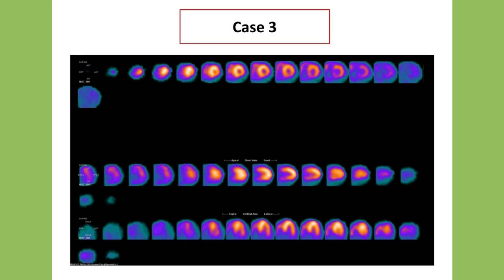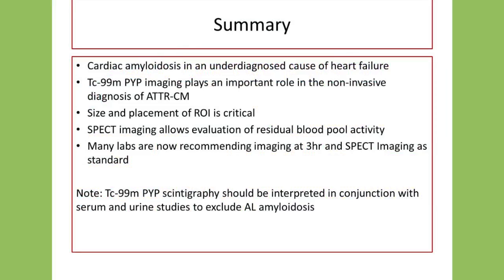So again, looking at the difference between having a negative study with a low ratio processing as a general nuclear medicine study compared to those patients that have suspected uptake, much easier to process as the MPI study versus the general bone study.